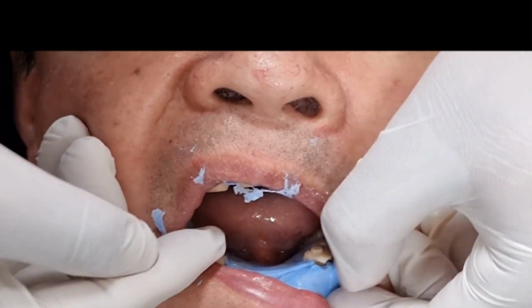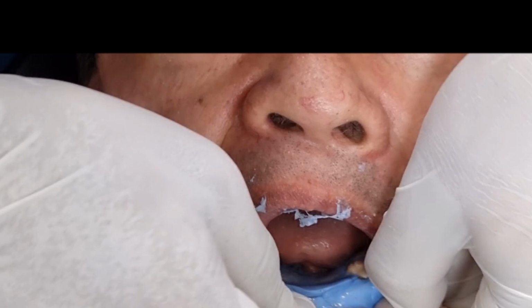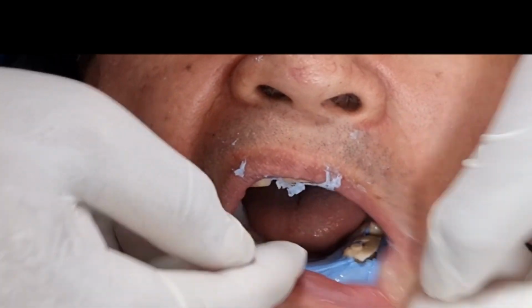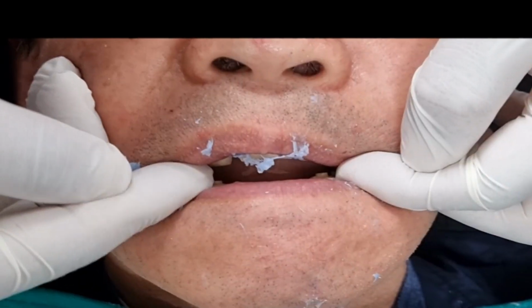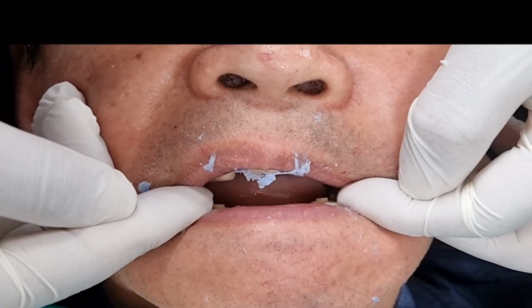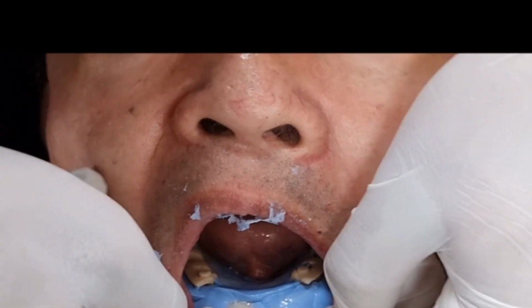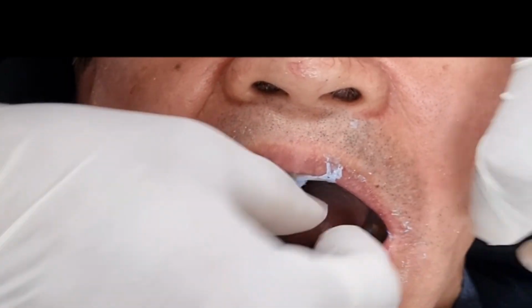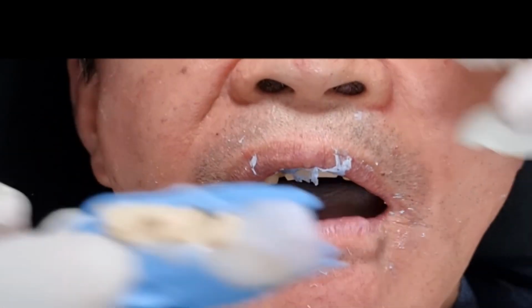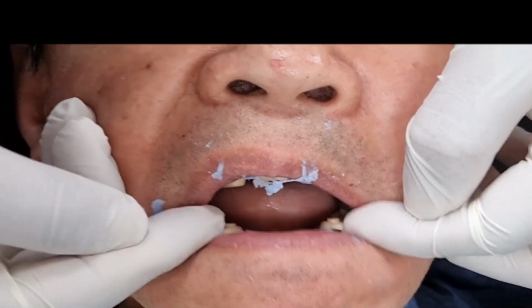With good suction and good retention, this impression can provide stability even in resorbed cases. However, if retention is excessive, adjustment can be made for patient comfort. In the case shown, the final impressions with the JB tray produced excellent retention and were similar in accuracy to the individual tray impression.